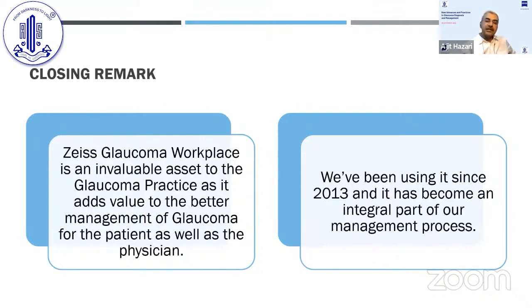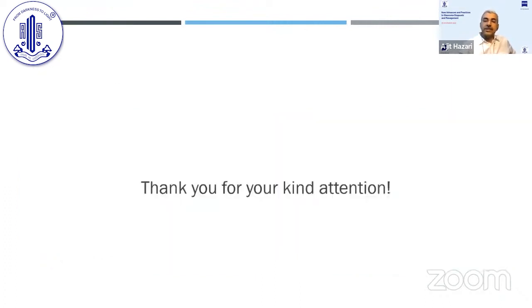So the Zeiss Glaucoma Workplace is an invaluable asset to glaucoma practice, as it adds value to the better management of glaucoma for the patient as well as the physician. And I can vouch for it because we've been using it since 2013, and it has become an integral part of our management process.